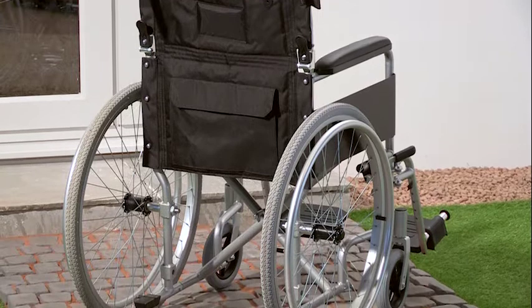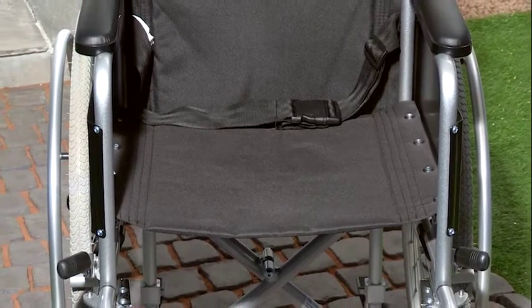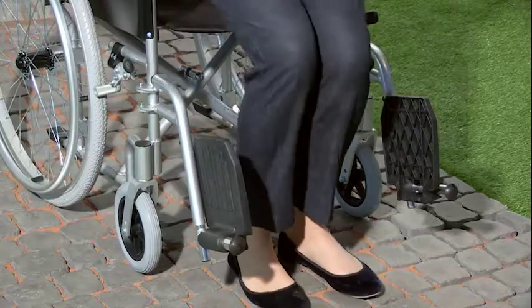It has a maximum weight capacity of 18 stone, which is 115 kilograms, and a comfortable 18-inch seat width. It also features swing-away footrests and parking brakes, making it easier to get in and out of the wheelchair.